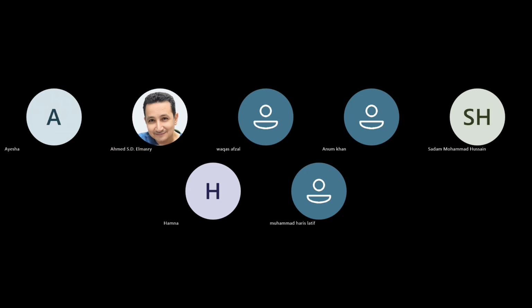From my experience, physician, you must have some other aspects from your clinical side, but from the professional side, on a personal basis, I don't feel it's a very safe practice to leave the sheath there and just remove the intra-aortic balloon pump. Most of these patients are getting heparin infusion, aspirin, Plavix, and some patients are getting Aggrastat, so the risk of bleeding is high.